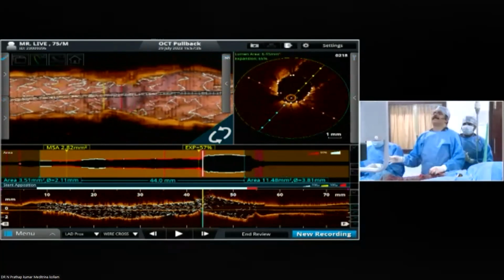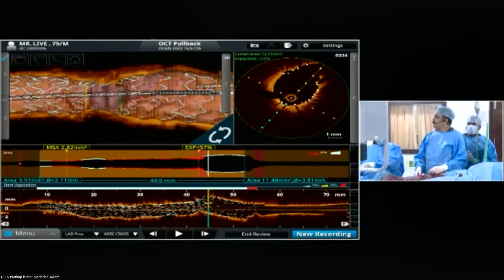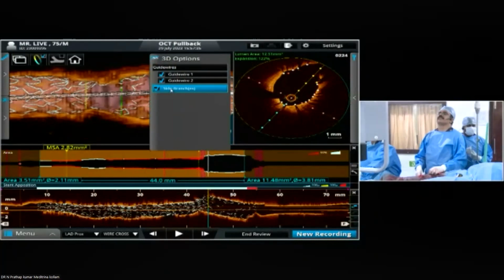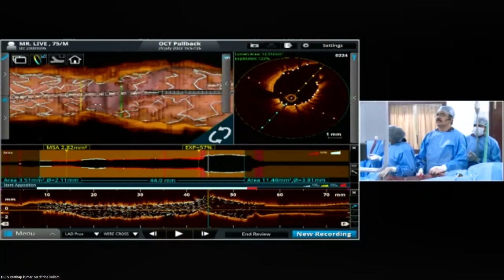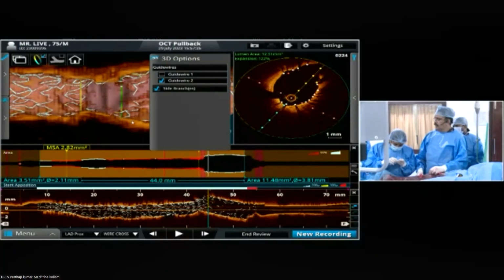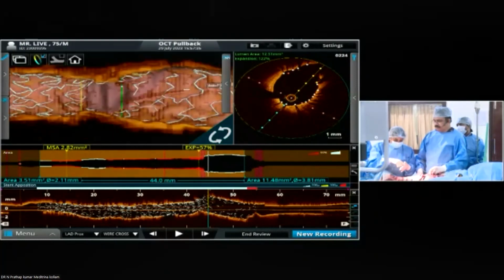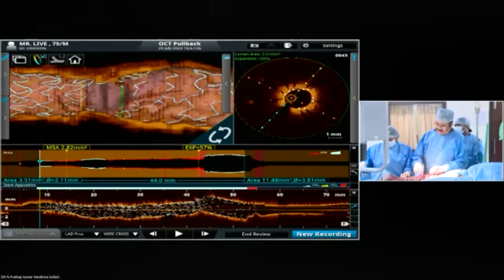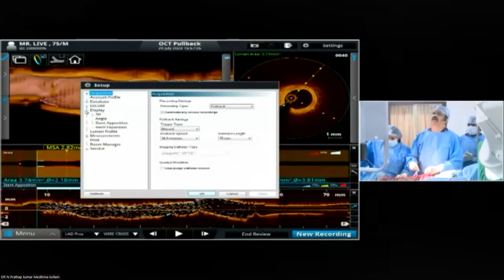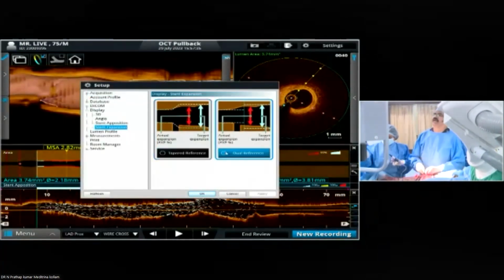I wanted to know the previous LAD stent which was placed during the previous balloon coronary event. Was it up to the ostium or beyond the ostium? Up to the ostium. So in this case, one option can be we place a single stent from left main to LCX, and we prepare the LAD ISR lesion very well with the cutting balloon and other methods. Then the strategy should be from LMCA to circumflex one stent, and you do a POT to the LAD ostium.